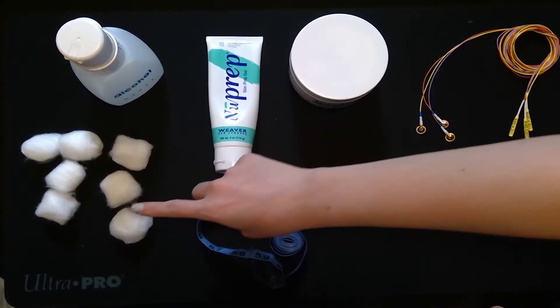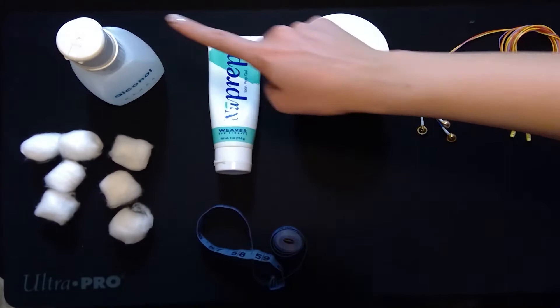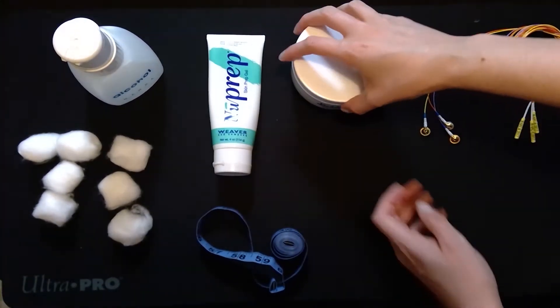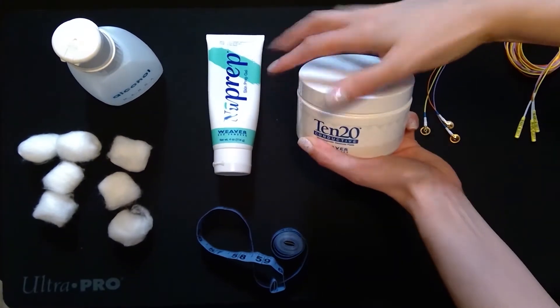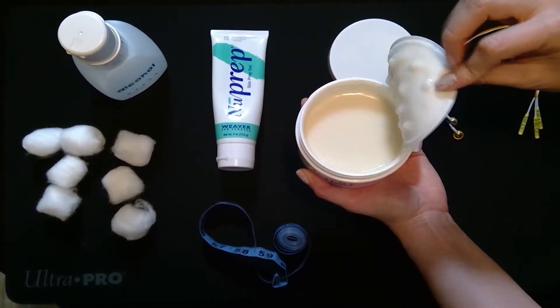So how do you attach electrodes? The supplies you'll need are cotton balls, alcohol, NuPrep — this is part of cleaning the skin — and 1020 paste, which is used to attach the electrode to the head.